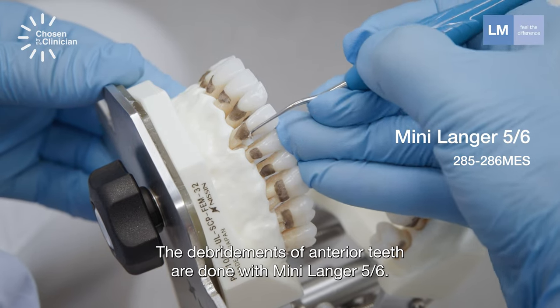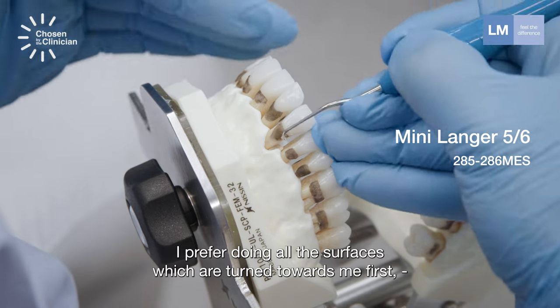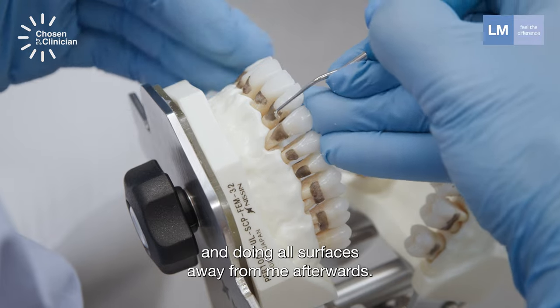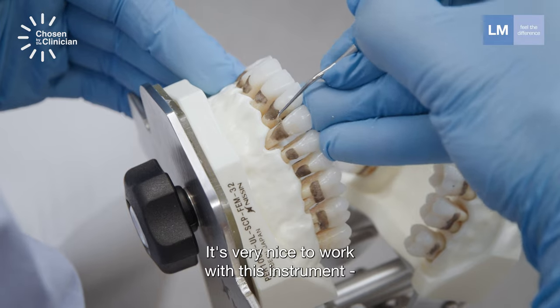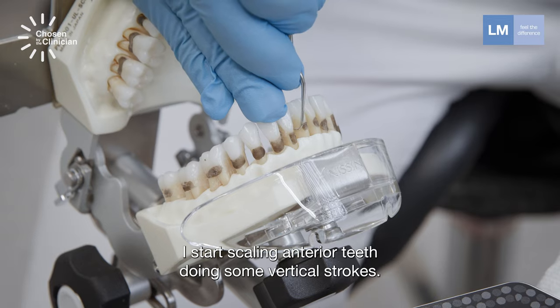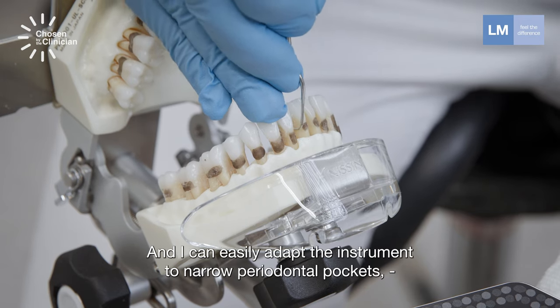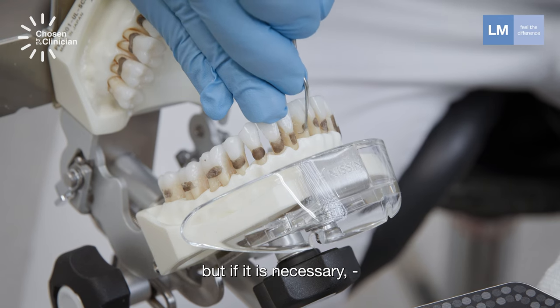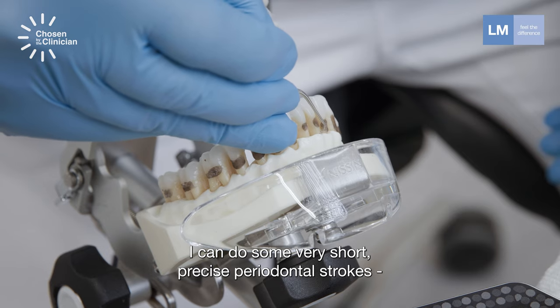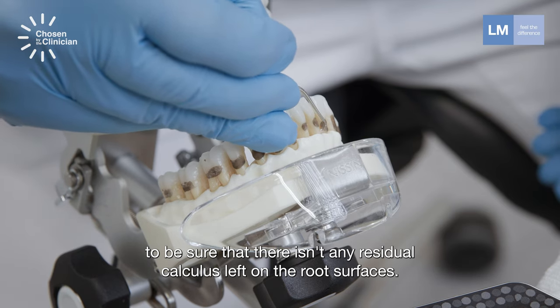The debridement of anterior teeth is done with Mini Langer 5/6. I prefer doing all the surfaces turned toward me first, and then flipping the instrument and doing all surfaces away from me afterwards. It's very nice to work with this instrument in deep and narrow periodontal pockets. I start scaling anterior teeth doing some vertical strokes, and I can easily adapt the instrument to narrow periodontal pockets. If necessary, I can do some very short, precise horizontal strokes to be sure there is no residual calculus left on the root surfaces.